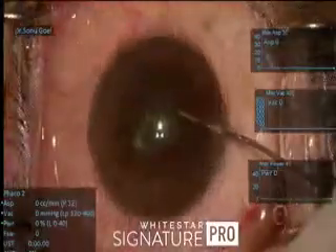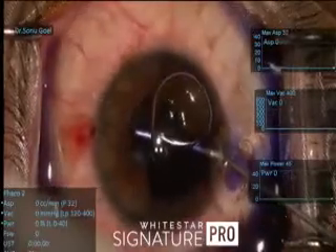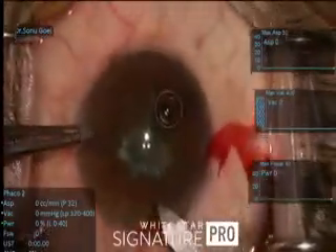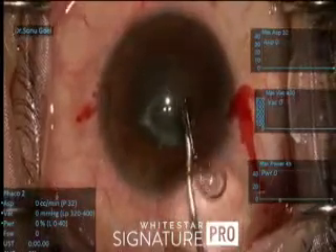A female with a non-dilating pupil and a posterior subcapsular cataract mimicking a posterior polar cataract. The iris looks floppy in this case, so we go in with cohesive viscoelastic, but the pupil is not sufficient to give us a 5.5 millimeter capsulorhexis. So what we plan to do here is a Malyugin ring.